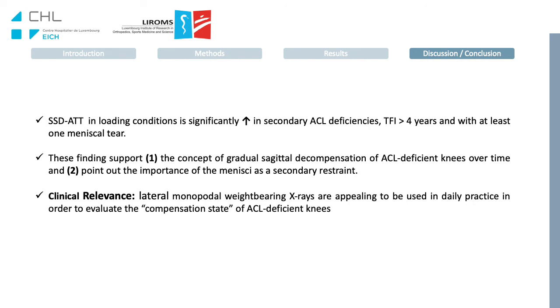Clinical relevance is that lateral monopodal weight-bearing X-rays are very appealing in clinical practice to be used in order to evaluate the compensation state of the ACL deficient knees.